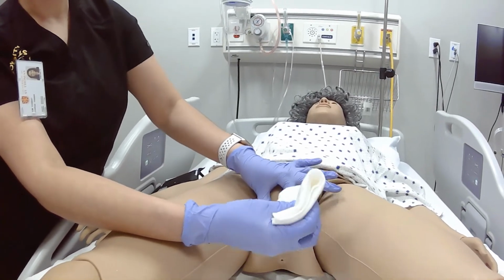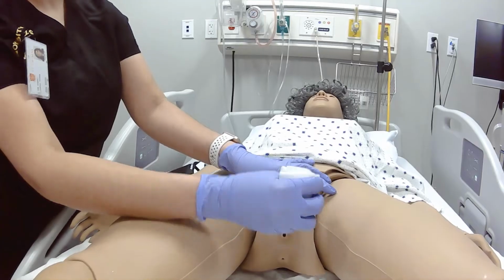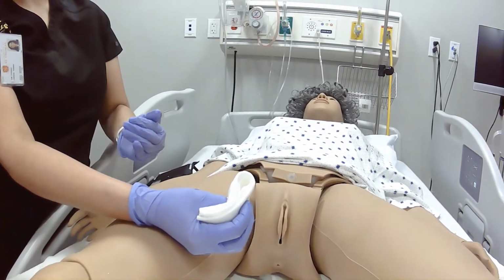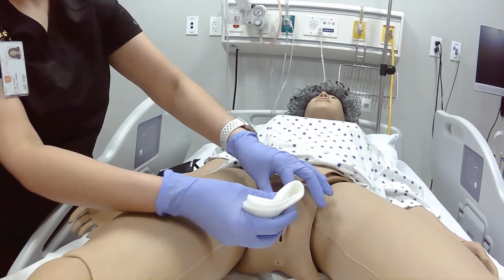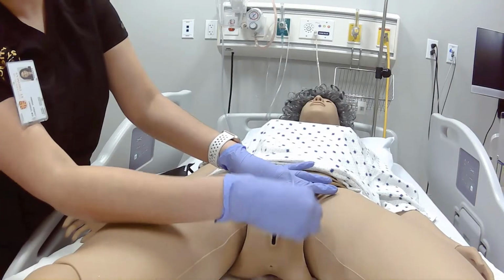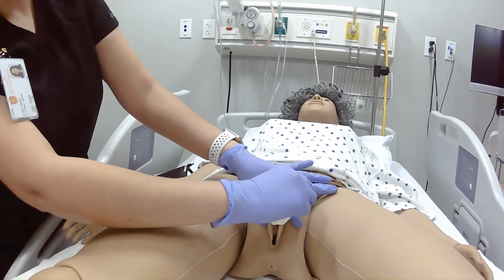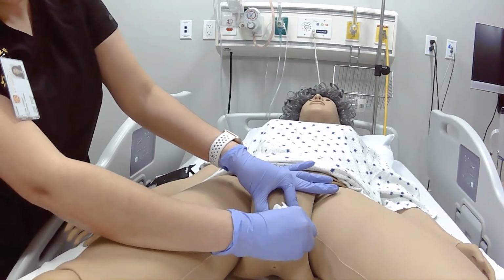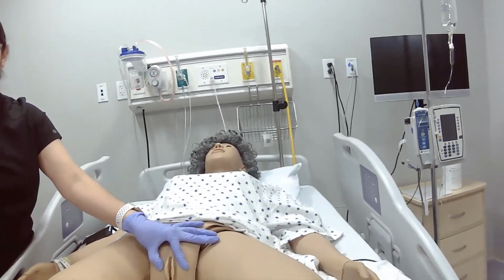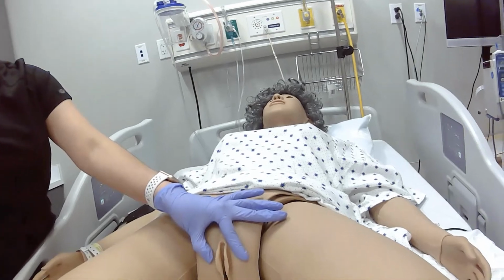So the first wipe that you're going to use, you want to start distal, and then do proximal, and then down the middle, okay? So we're going to start from top to bottom, one wipe. We're not going to go back up. So top to bottom, one wipe, top to bottom, and then we come across, come around, okay?